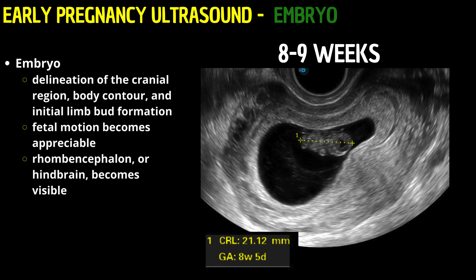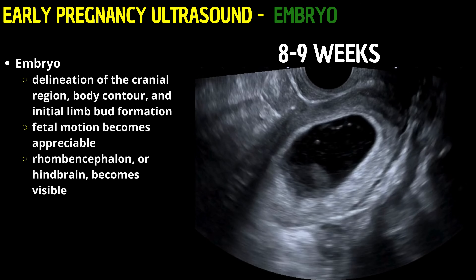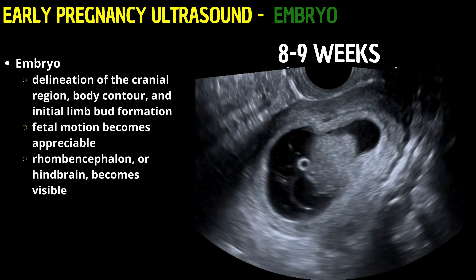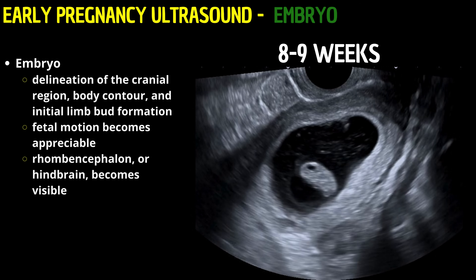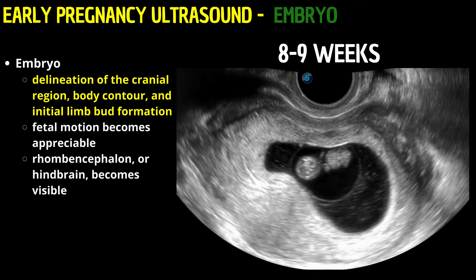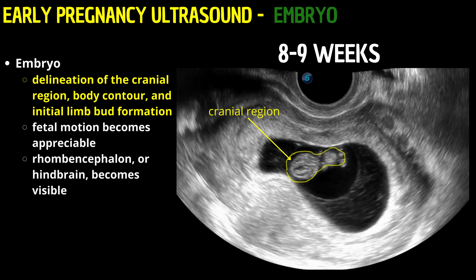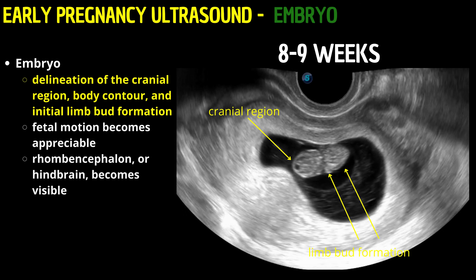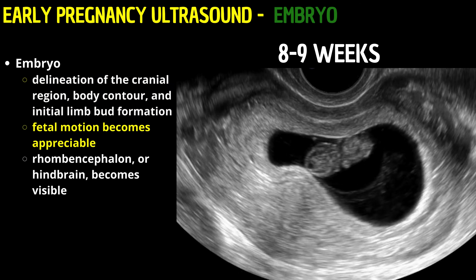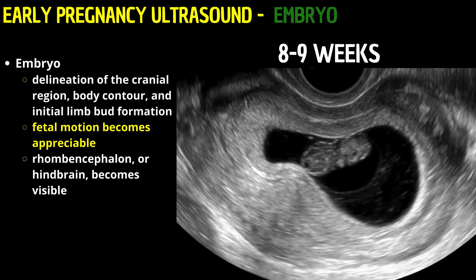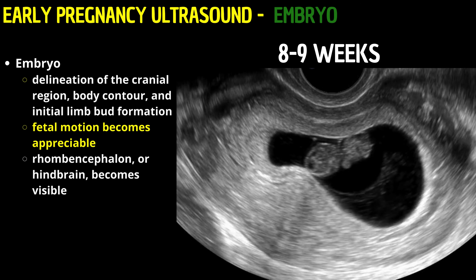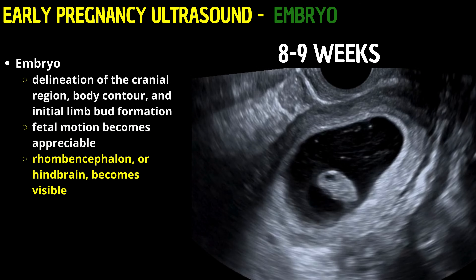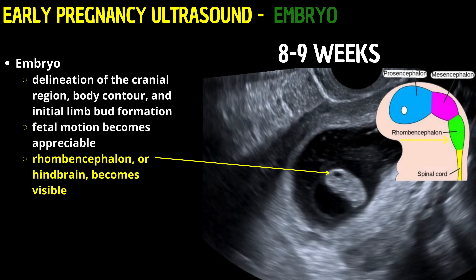At 8 weeks and 5 days of gestational age, the ultrasonographic examination showcases a more delineated embryonic architecture. The embryo is distinctly discernible within the gestational sac, displaying notable morphological advancements such as delineation of the cranial region, body contour, and initial limb bud formation. Between 8 and 8.5 weeks, fetal motion becomes appreciable on ultrasound — a critical sign of nervous system development and overall embryo health. From 8 to 10 weeks, the rhombencephalon, or hindbrain, becomes visible, significant for assessing the central nervous system's early development.